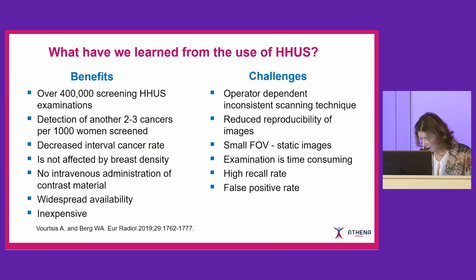However, with handheld breast ultrasound, there are several challenges. We know that this technique is operator dependent, so the result of the ultrasound depends on the experience the radiologist has. And in the States, a lot of ultrasounds are performed by technologists. This means that the radiologist is receiving static images for evaluation and not the whole examination.